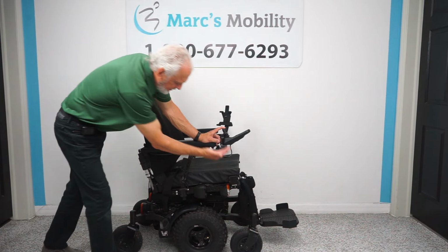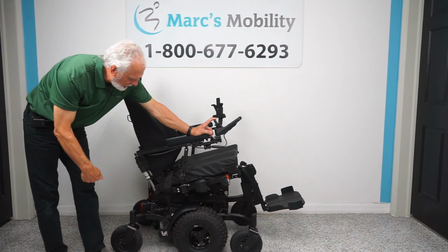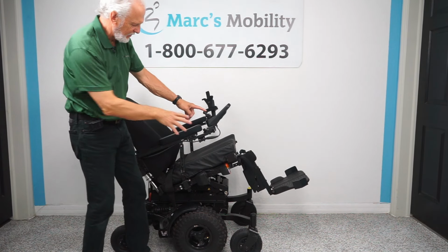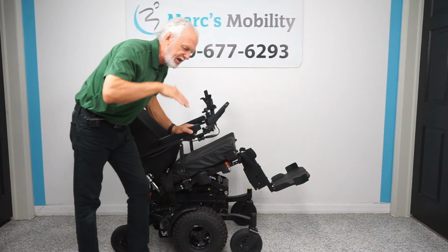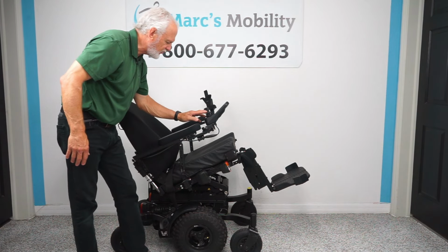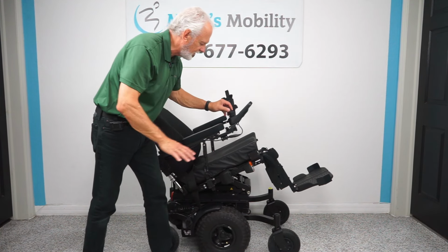The tilt is when the bottom goes back. So if you're going to tilt the seat, of course the legs and the back are all going to go back together because they're all connected. This is called electric tilt. Now some people tilt their seat like this when they go down a steep hill. So if you had it in drive, back to drive, you could drive down the hill in a steep hill and still be fairly level, okay?